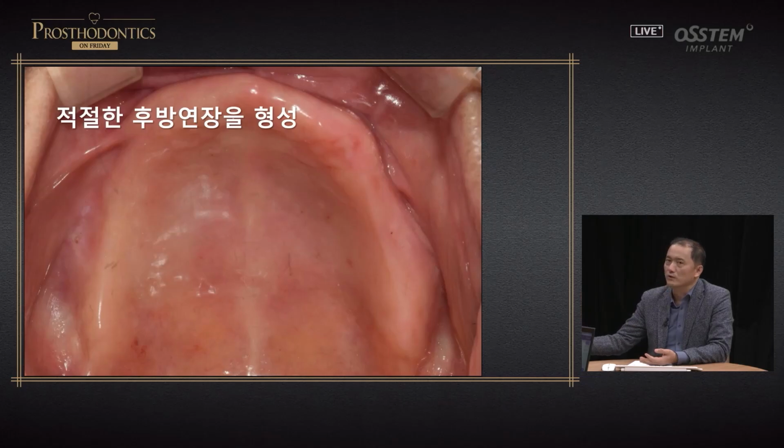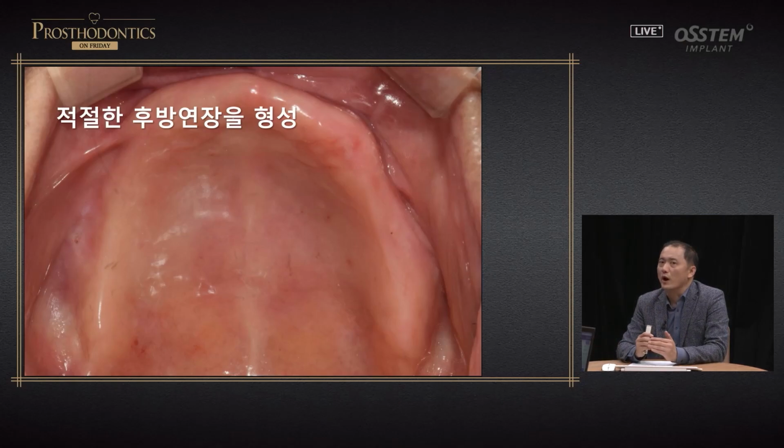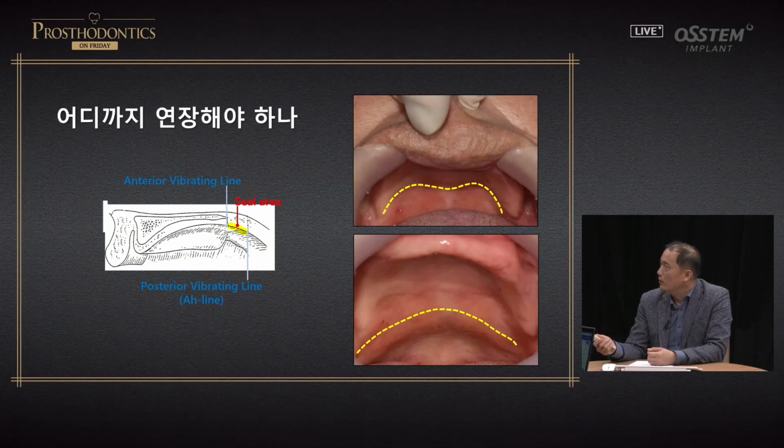And in this case, to increase retention, you might extend to the distal side, going for maximum distal extension. But if the ridge is really bad, excessive distal extension could result in easy detachment of the denture. So you need to have the adequate level. As you know, the scope of extension is up to the AH line. So between the anterior and posterior, by giving pressure, you maintain it.